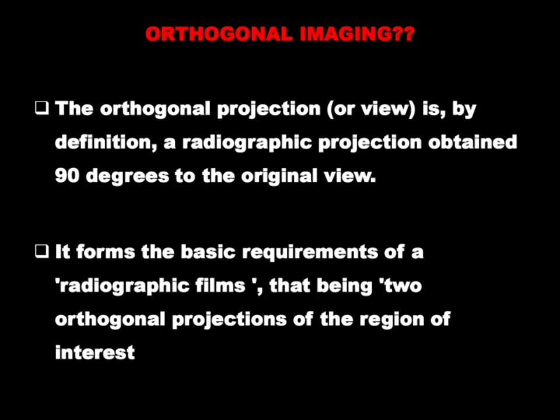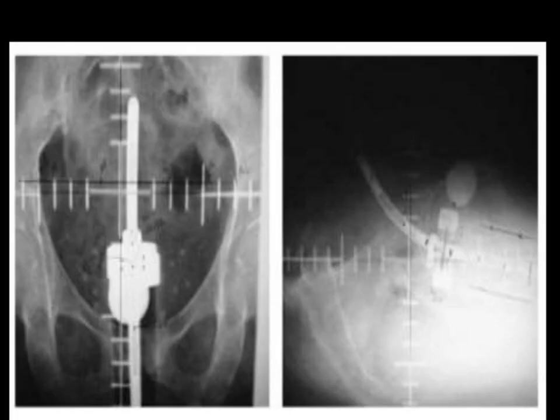Sometimes the linear accelerator is equipped with a high kV imaging system and EPID, so that information goes to the console, and from the console through the DICOM server to the treatment planning system, where repositioning, recorrection of the image and replanning is done to get a final say for contouring as well as treatment execution.